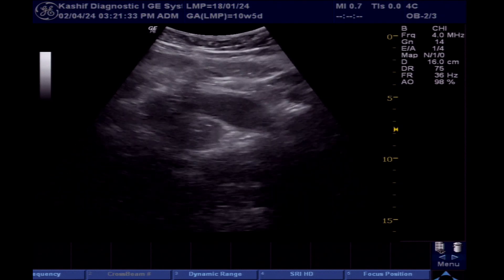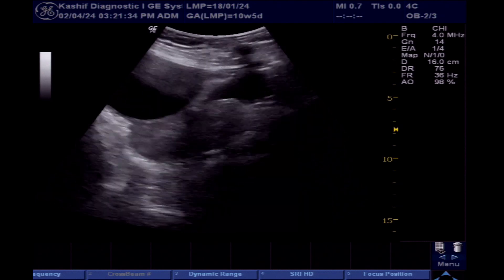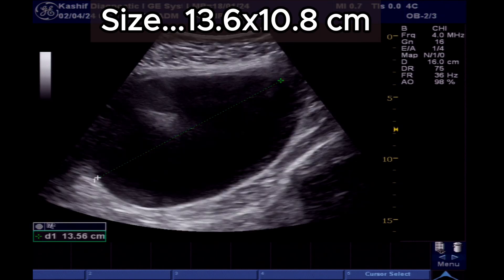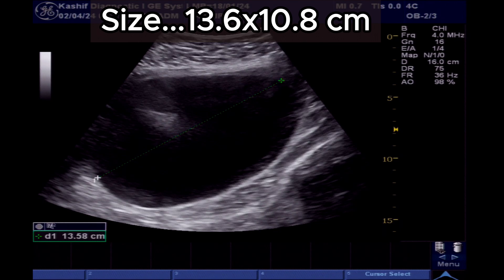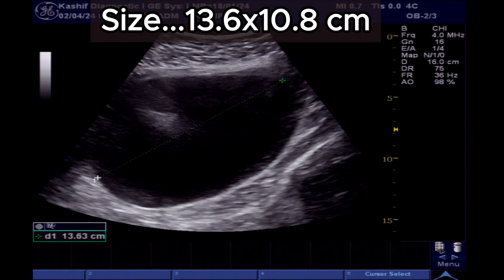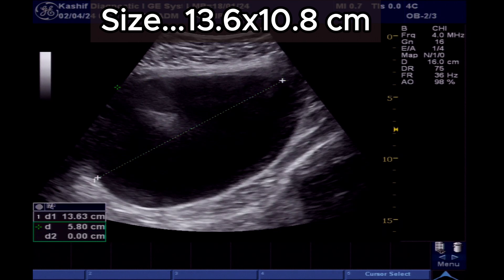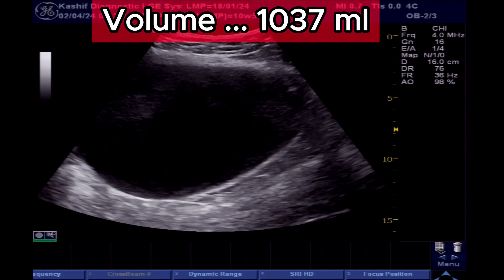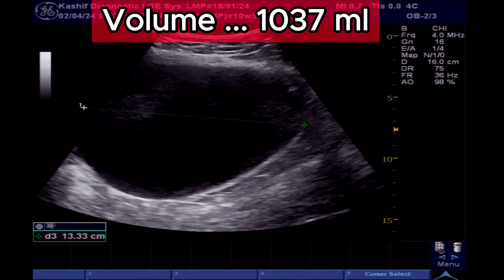The large cystic area is an ovarian cyst. This is huge, measuring 13.6 x 10.8 cm in size. Its volume is over 1000 ml.